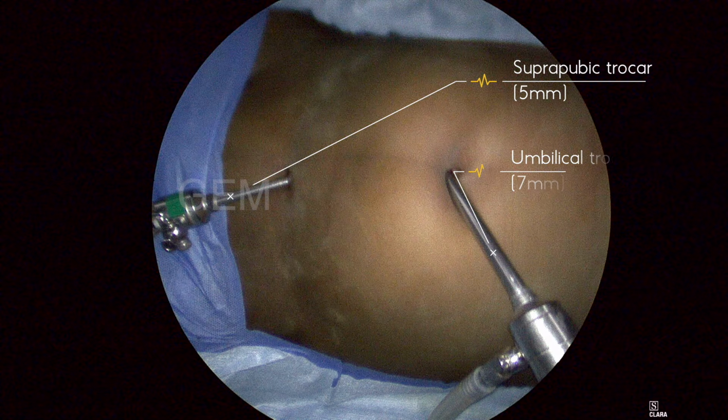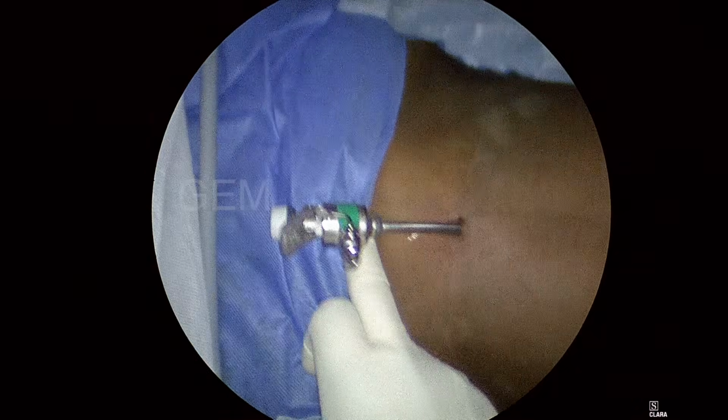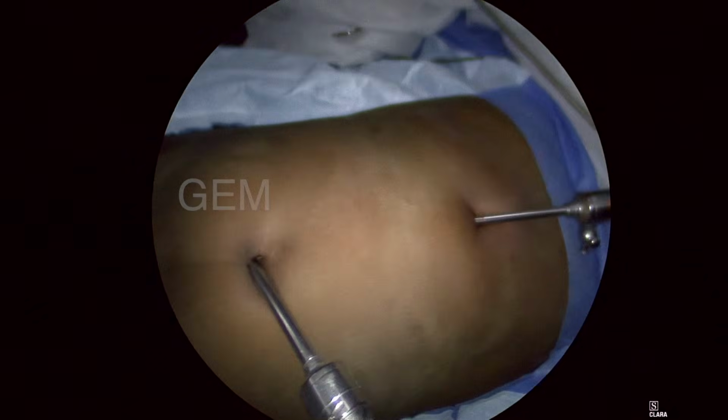I always make the umbilical trocar 7 mm in appendix surgery, so most of the appendix I will take out through the 7 mm. Sometimes I change to 10 mm. The suprapubic is always 5 mm for the camera. That is the symphysis pubis, and I am making the camera port just above the level of the pubis.